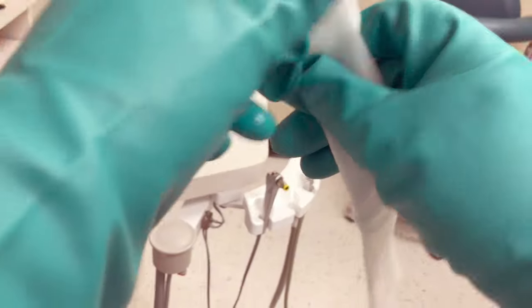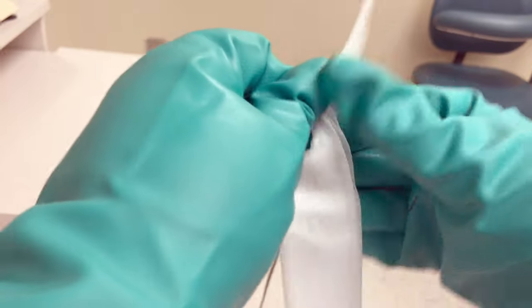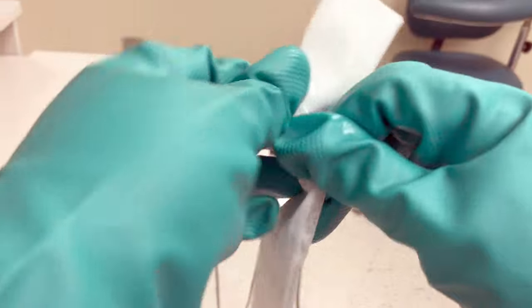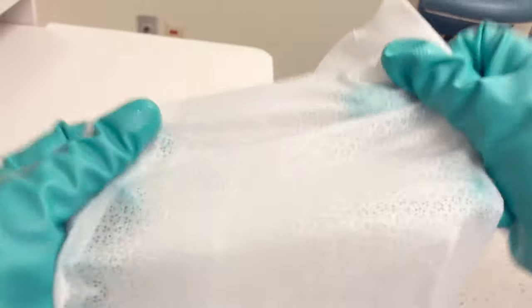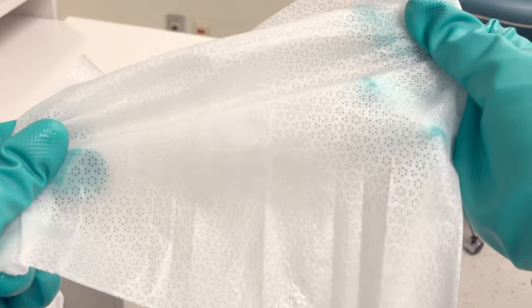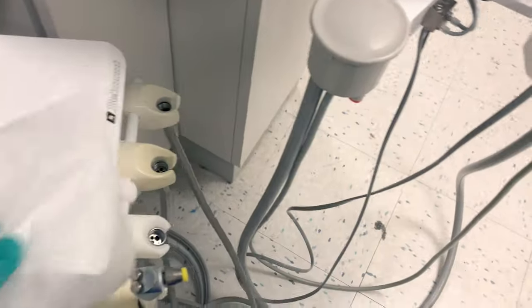Open up your towelette — sometimes that's challenging with utility gloves. As with any cleaning procedure, make sure you are wearing all of your PPE as well as utility gloves. Open up your towelette; it makes it easier to clean your surfaces. Start wiping — this first towelette cleans the surfaces.